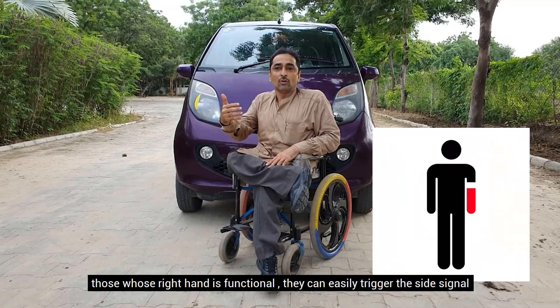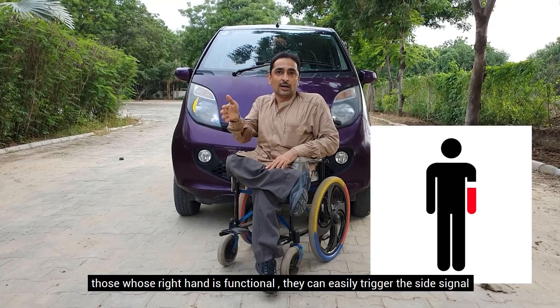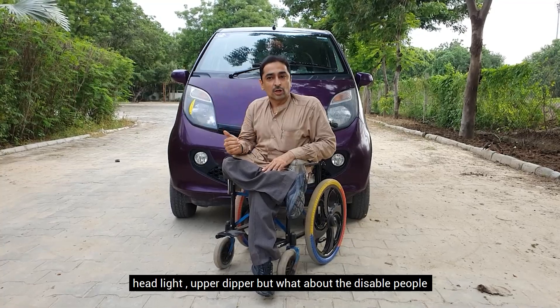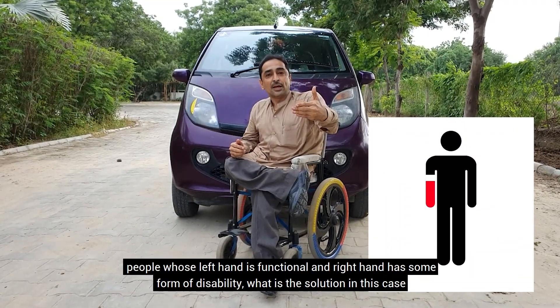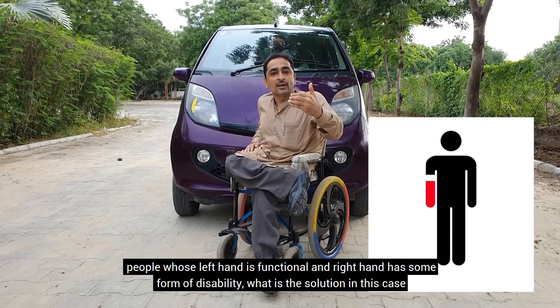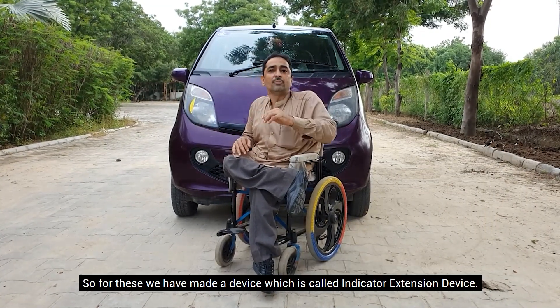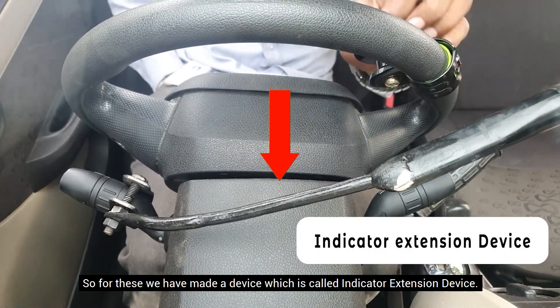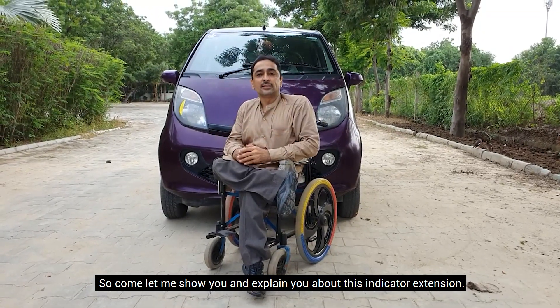If the right hand is okay and the car is running, they can easily control the side signals, headlight, and upper dipper. But if the left hand is okay and they have a disability in the right hand, what should happen for them? We have made a device for them, which is called the Indicator Extension Device. Let us tell you what the Indicator Extension Device is.